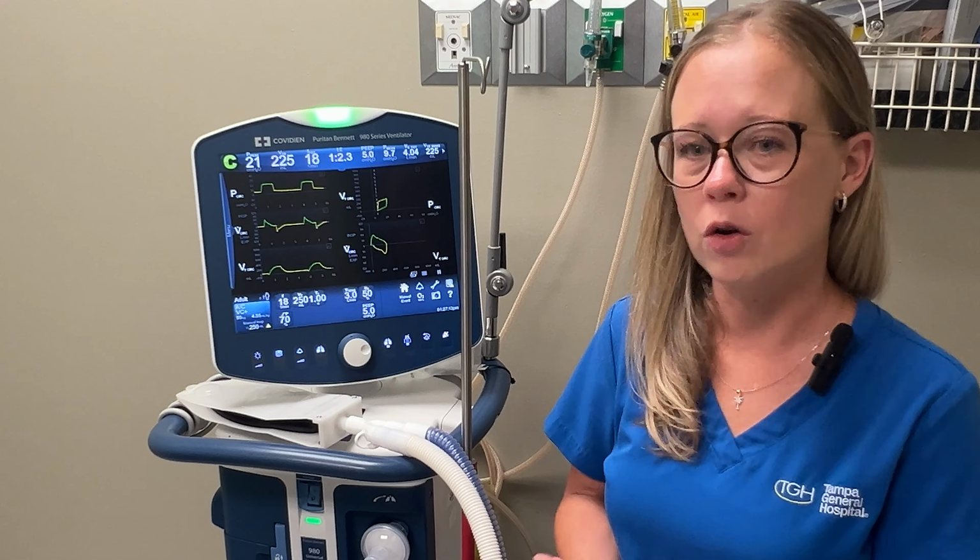All you have to do is press it. It tells you how long that patient will receive that 100% FiO2, and you see that the O2 is flashing 100. You don't have to stop this unless you want to. When the time runs out, it just returns back to where it's supposed to be. So I can hit stop and see it goes right back to the FiO2 that was set previously.